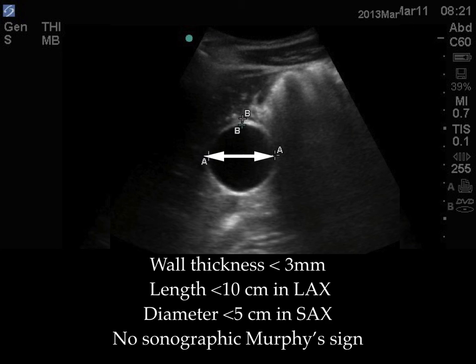And I'll say, does it hurt more when I press here over the gallbladder? Then I'll slide my probe so that I know that I'm at least 5 to 10 centimeters away from it, and then I'll press down again. And I'll ask them, does it hurt more when I'm directly over the gallbladder or when I'm to the side? Again, we're confirming this binary question: is there a sonographic Murphy sign? Yes or no.